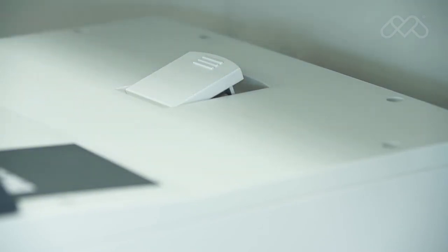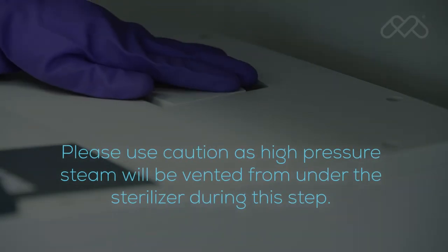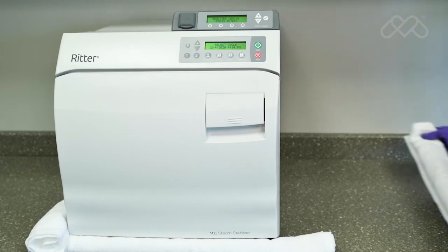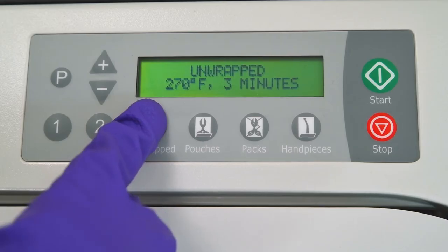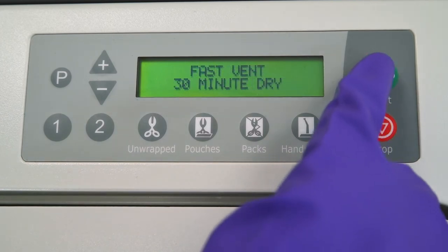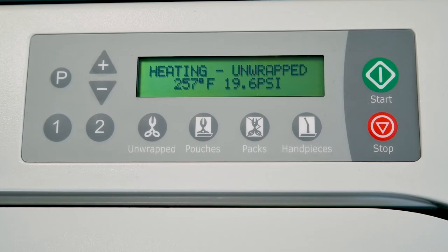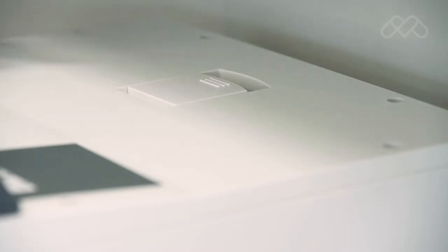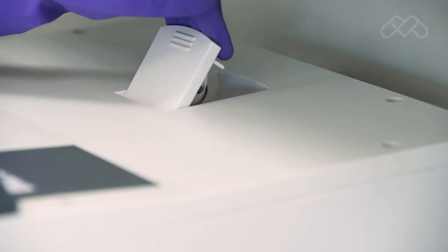The final part of the required monthly maintenance involves verifying proper operation of the pressure relief valve. Please use caution, as high pressure steam will be vented from under the sterilizer during this step. Place a rolled towel around the bottom of the unit to act as a steam barrier. Press the unwrapped cycle and start buttons in succession. Monitor the display and wait for the pressure to reach 20 psi. When 20 psi is reached, pull upward firmly on the relief valve lever on top of the sterilizer and hold it open for 3 seconds.